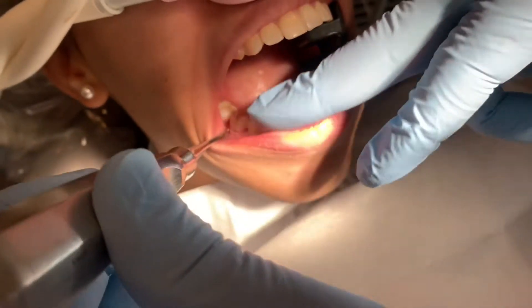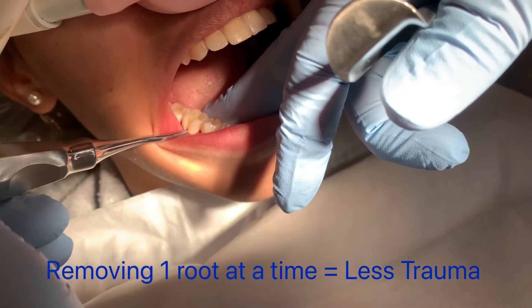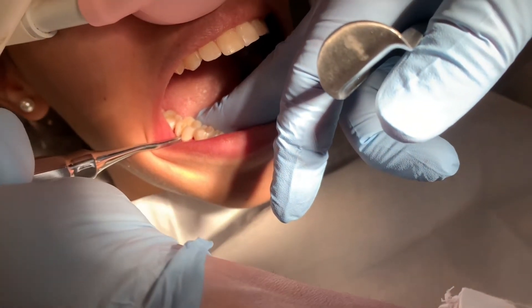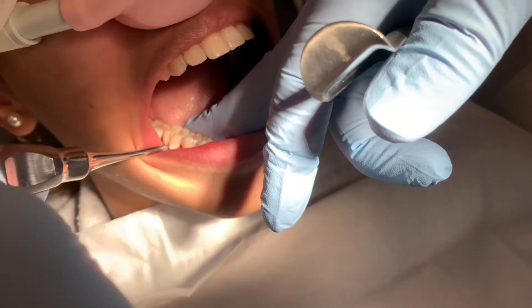The next thing I'll do is get in here and make sure we have the tooth in two pieces. I'm just going to wiggle this — you may hear a little pop or something. Gets into two pieces. You can hear a little bit of stretching noises sometimes.